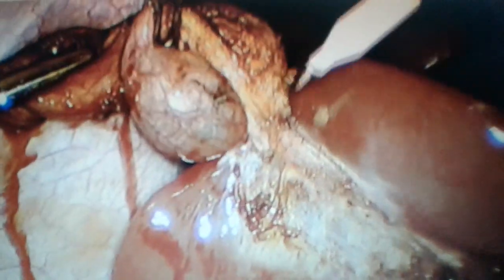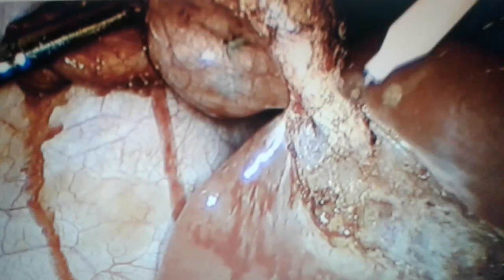And during interaction of human being and machine, sometimes minor problems may arise. So we must be competent enough to manage these problems instead of having a complaining behavior, till the patient is fine.